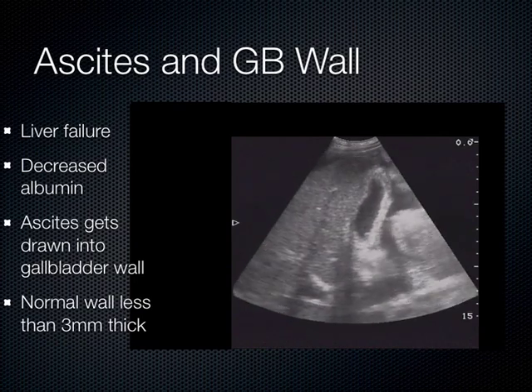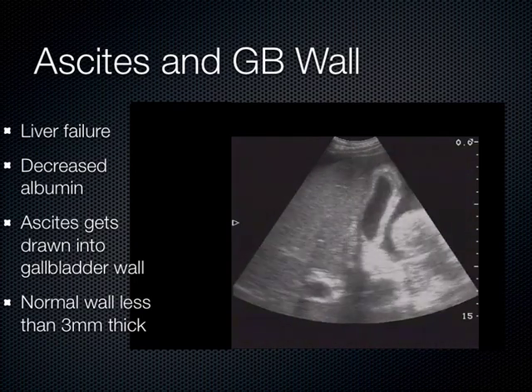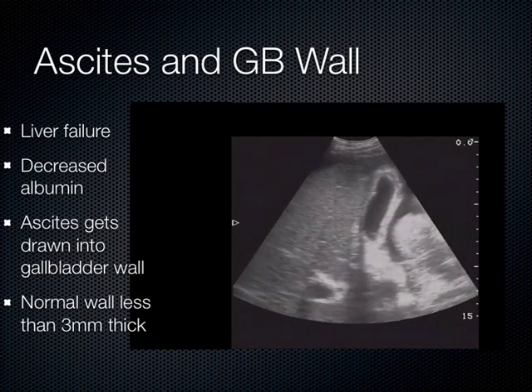So it depends what the models had for lunch. Most of the time, it's almost impossible to eat 0 fat. So usually their gallbladders are a little contracted, making them a little bit hard to find.